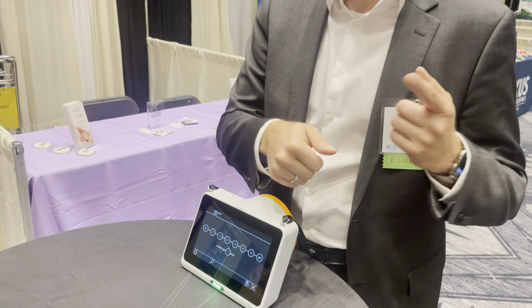on the person. Means I'm good, I'm within the thresholds, no need to see a doctor. When I tap here once, I can zoom in and see the red reflex. If I saw black dots, black stripes, something that looks like a cloud, that could all be potential cataracts, scars, or abnormal reflexes from the retina.